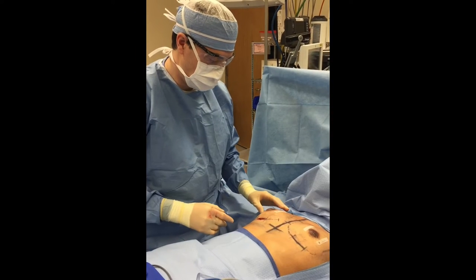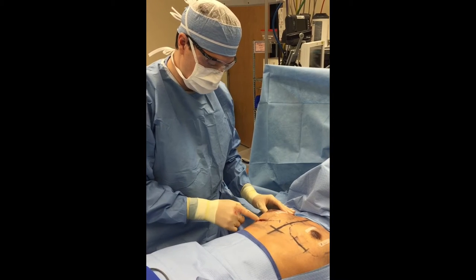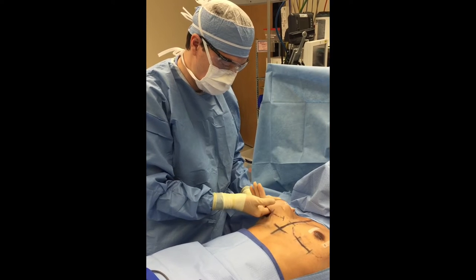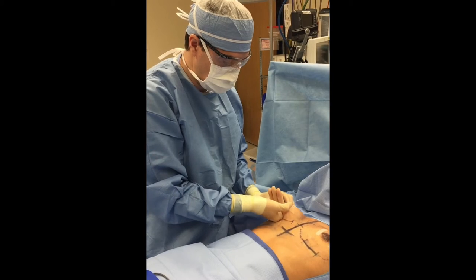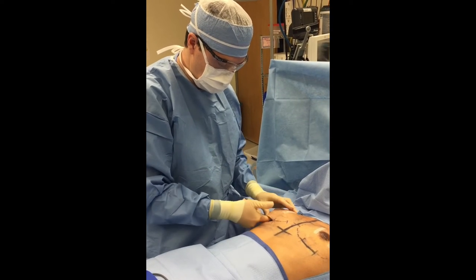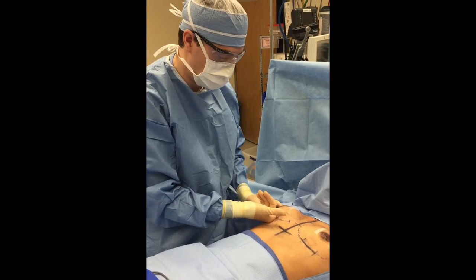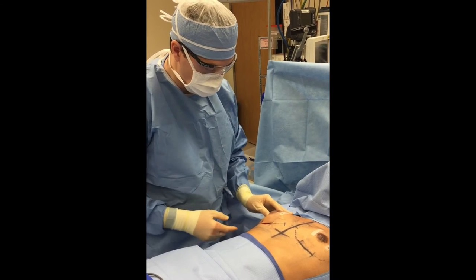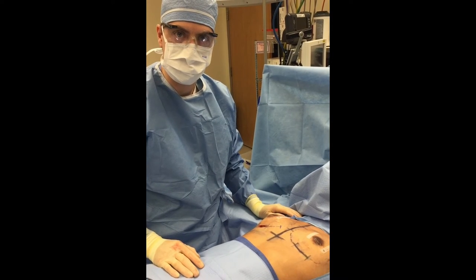We've completed the pocket elevation on the right side. You can see she has a little incision here, and we've made our pocket under the muscle. It goes right up to our lines where we planned preoperatively and made a place for the implant. So now we're going to wash things out real well — you can see there's not any bleeding — wash things out and put the implant in. I'll come back and show you the results.